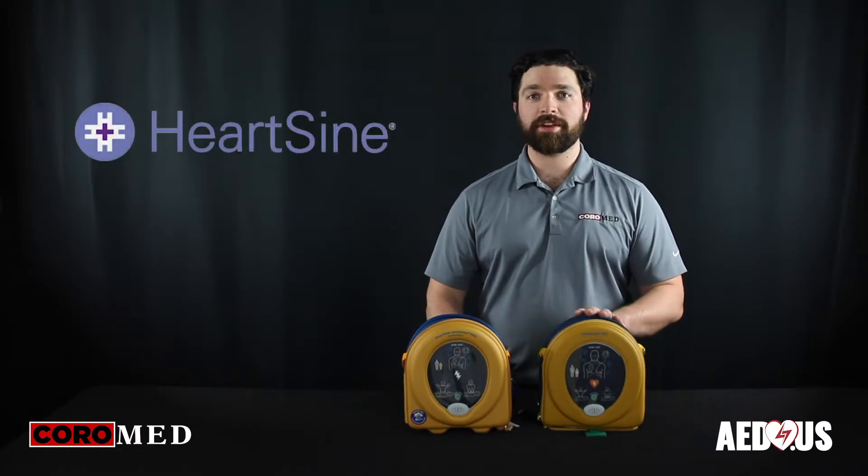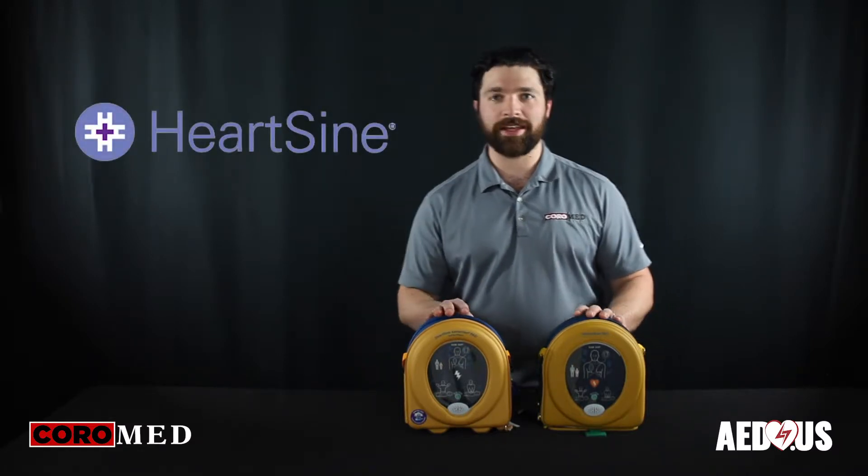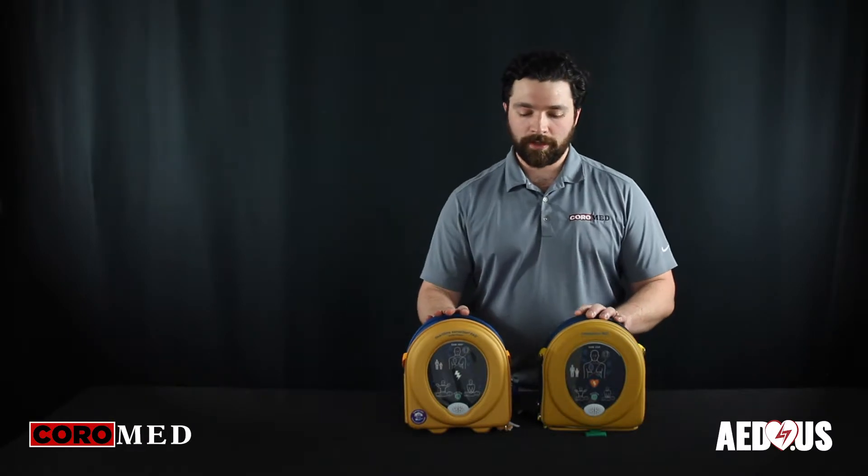Today we're going to talk for a few minutes about the HeartSign 350 and 360P AEDs. Now both of these devices share a lot of similarities, which is why we're going to do both in one video.